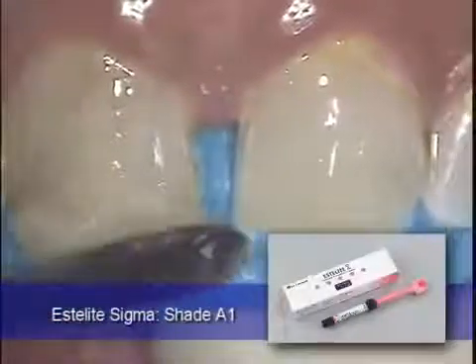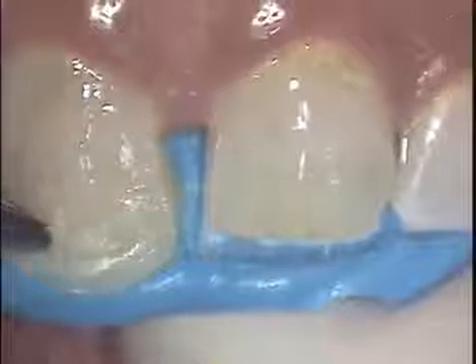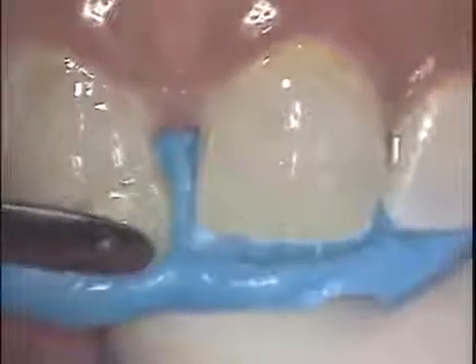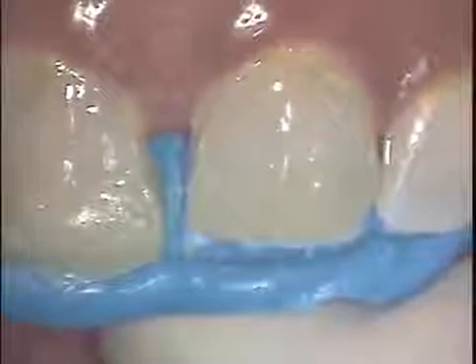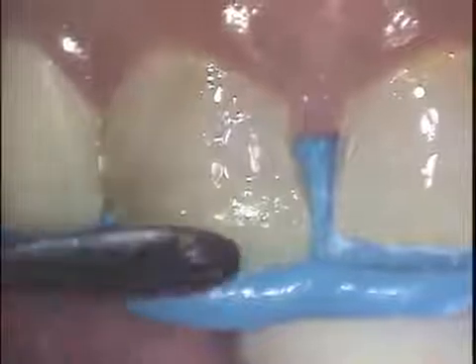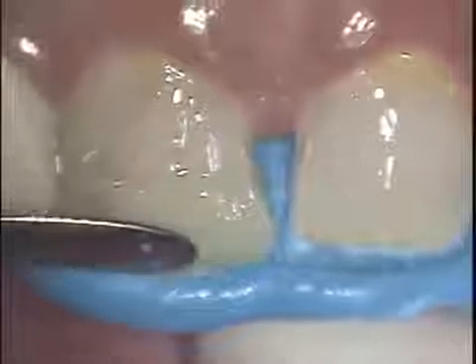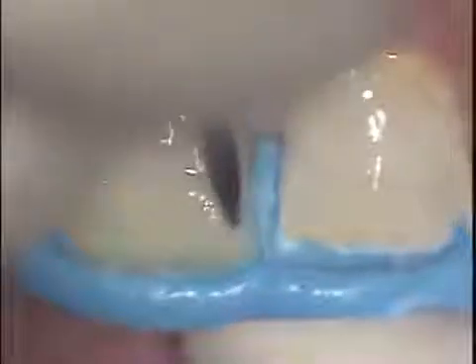In this case, we're using the shade A1 Estelite Sigma composite paste material. It's sculpted on the upper right central incisor against the tooth as well as the putty matrix. Using this technique, it's easy to see the tooth take form and shape almost immediately.